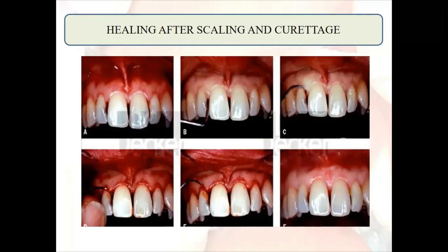You can see that first of all, there was gingival inflammation. The surface texture was lost. There was edema present over there. The color of the gingiva became bright red. There was even pocket depth when we assessed it with the aid of a calibrated periodontal probe. It was more than 3 mm. And it was quite edematous, with a kind of soft gingival consistency.